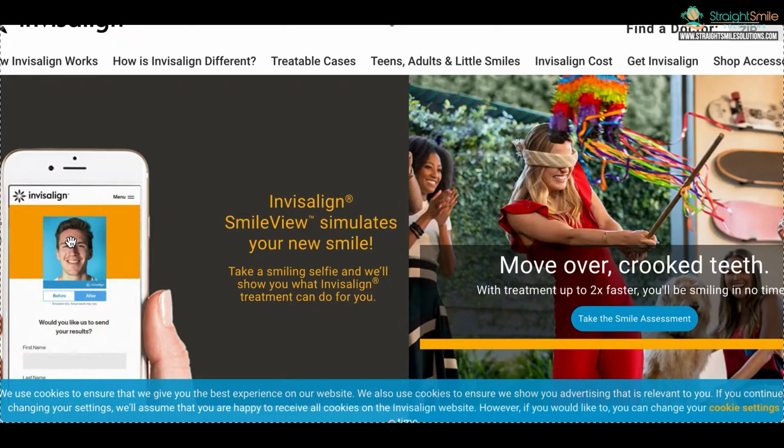The way I can see this being easier is if at the start, when you start the case at the delivery, you say, hey, we have a couple of options. We have the virtual care option, which will reduce some of your actual appointments. Obviously, there are benefits. It's going to be more convenient for you, and we can give you more aligners at one time. Let's do this right now while you're in the chair. Let's have you, with your parents, download it, set it up, opt in, and accept the terms and conditions.